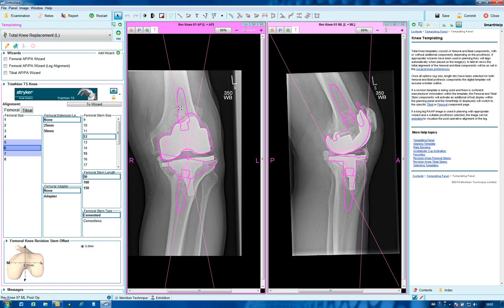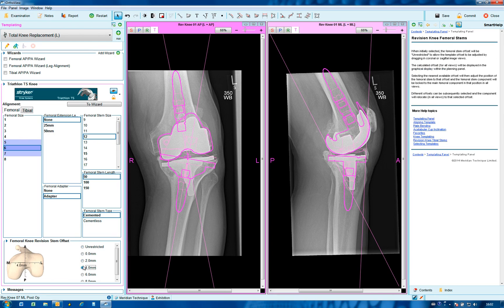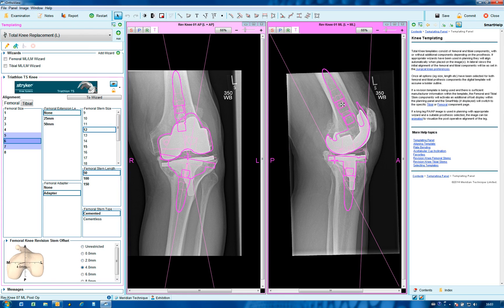At the moment there is no stem offset shown. If we wish to choose an adapter in either the femoral or the tibial component, we select adapter and an option list from unrestricted through to various offsets appears. In unrestricted mode, clicking on the image and moving the stem to an appropriate position gives an indication of how much — medially in this case — it's necessary to move to centralize the stem, and at the same time a choice can then be made for the offset. This can also be done in the lateral view as needed.